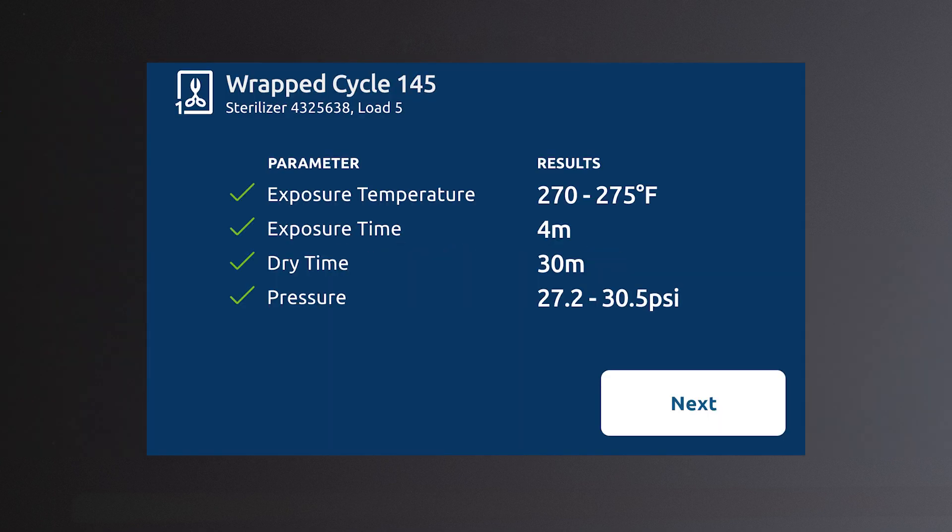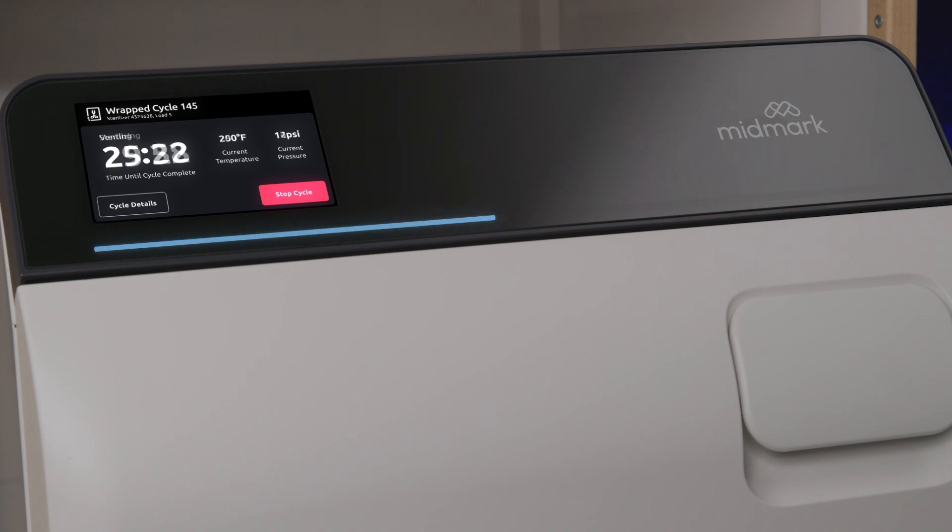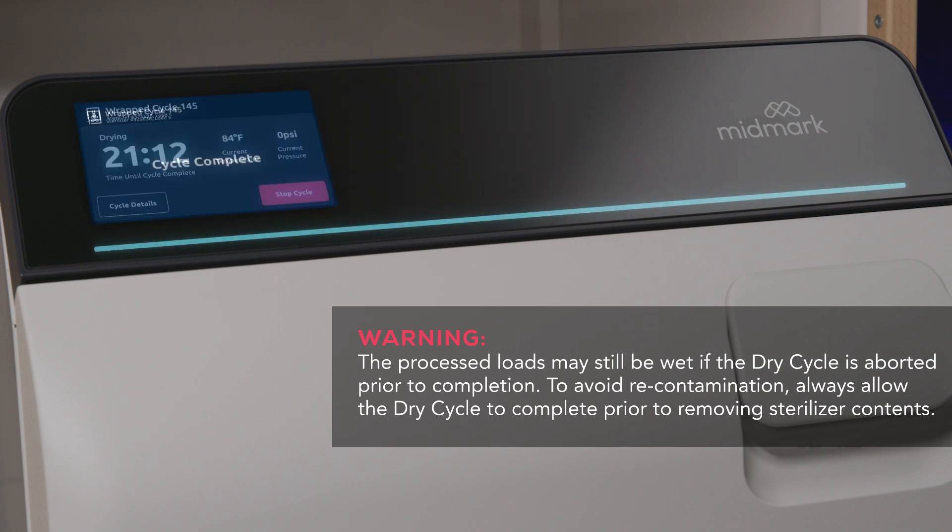As the cycle progresses, the light bar will move to the right. The current temperature and pressure in the chamber will be displayed. A timed countdown will start in the sterilization stage and continue until the cycle and drying are complete.